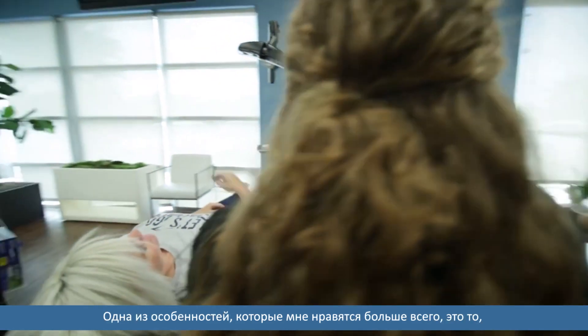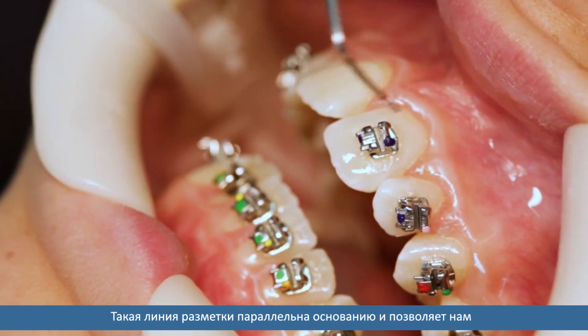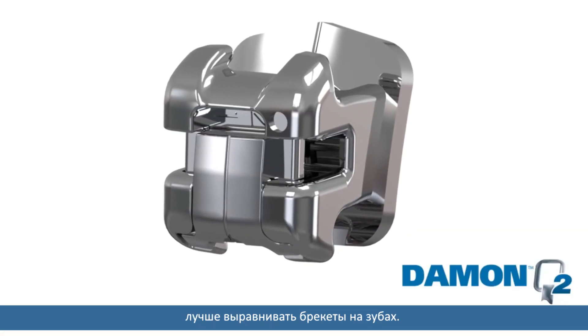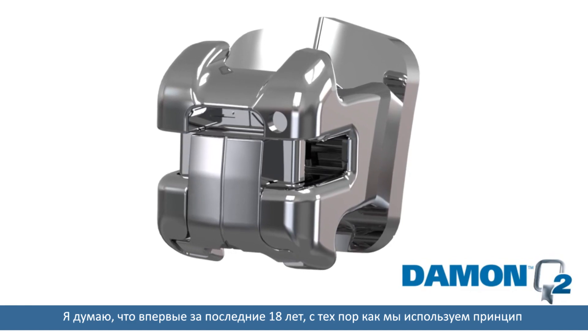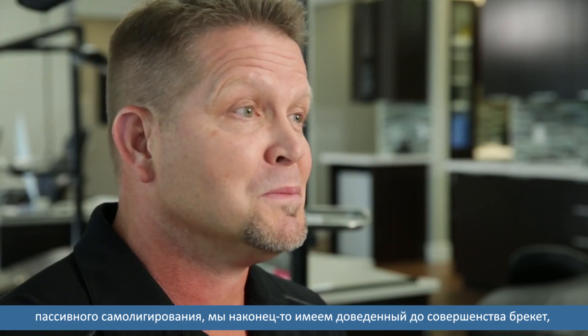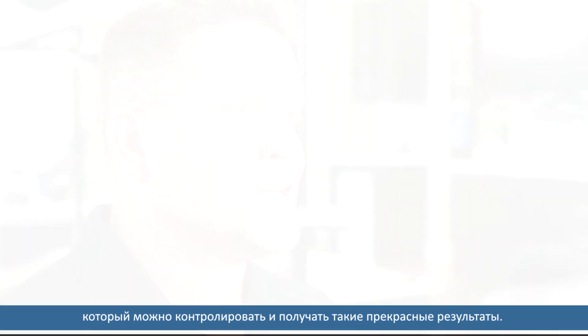One of the features that I love the most is that we have a scribe line on the door. That scribe line parallels the pad and allows us to line the bracket up better with the tooth. I think for the first time since we've had passive self-ligation over these last 18 years, we finally have got the bracket dialed in to where we can control and have these beautiful finishes.